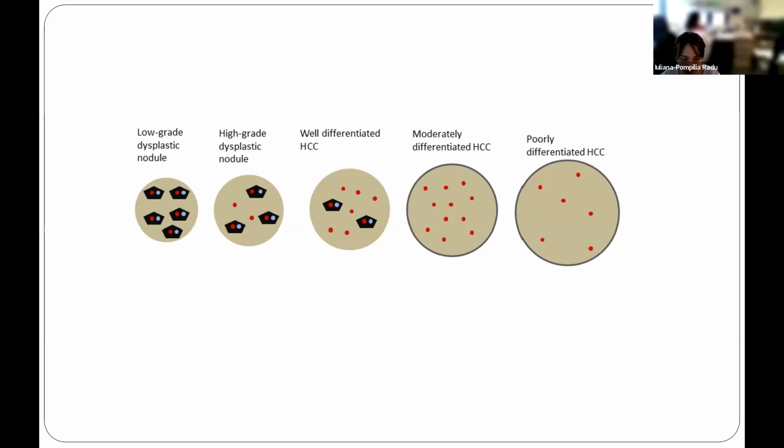Of course, in the literature, they say that if it's inflammatory, it's a homogeneous enhancement, but in reality, it's super difficult to make the differential diagnosis, because also in inflammation there can be small thromboses in the vessels and there can also be washout. So it's difficult.